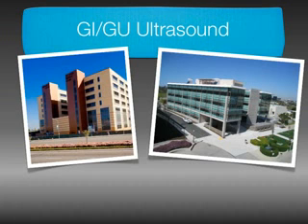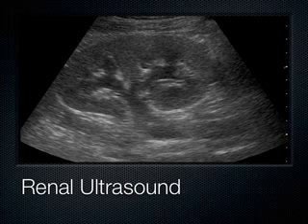So we're going to quickly transition today into the kidney and also some intestinal structures and the gallbladder. So this is the kidney, and you can see it here in all its splendor and glory. But to talk about the different anatomical parts of the kidney, this is the capsule of the kidney out here. Now the capsule is a very rigid structure, and when the kidney expands, it's got nowhere to go. And so it causes the patient a lot of pain if the kidney gets obstructed.